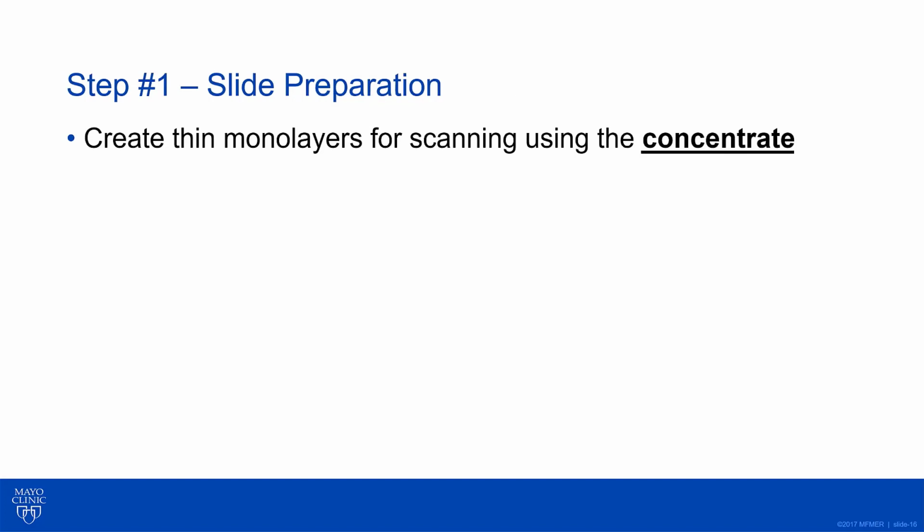So step number one, we had to change the way we prepared slides. First of all, very importantly, we had to create a thin monolayer of stool on the slide for scanning.